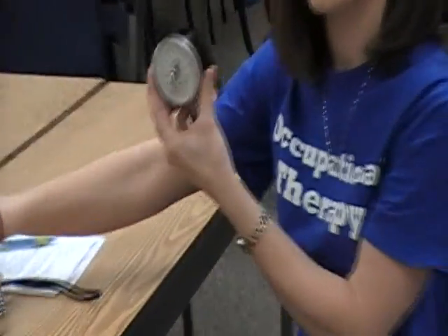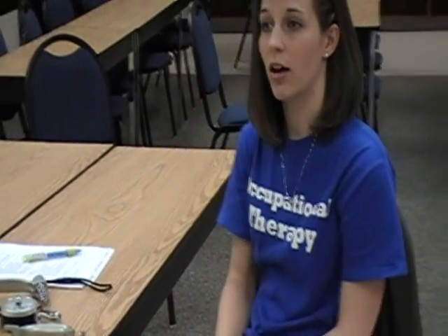Today what we're going to do is measure your grip and pinch strength using our dynamometer and our pinch gauge. The reason we're doing this is because a lot of functional activities require you to have a strong grip and a strong pinch.